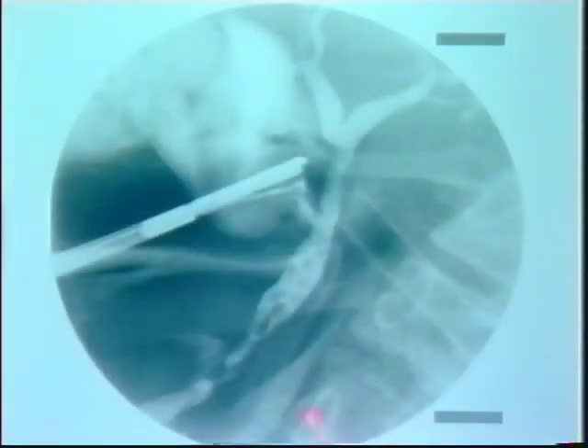In this cholangiogram, the jaws of the clamp could not be closed completely because there are too many stones in the gallbladder. So the dye leaked from the Hartman's pouch into the body of the gallbladder, but a cholangiogram is still obtained.